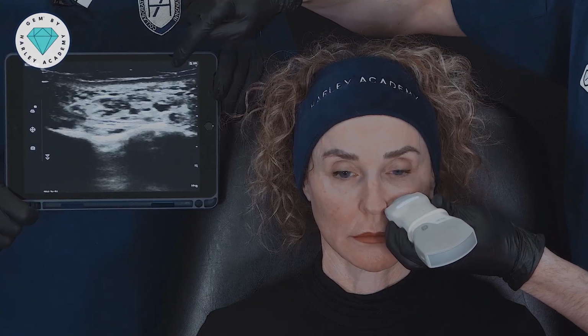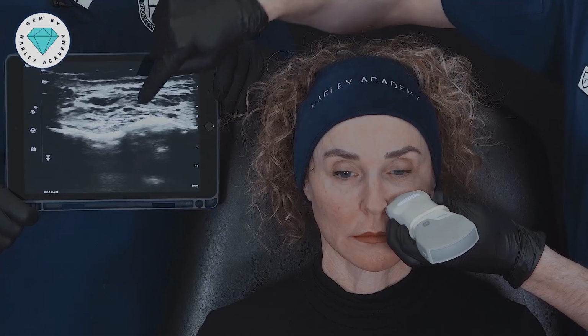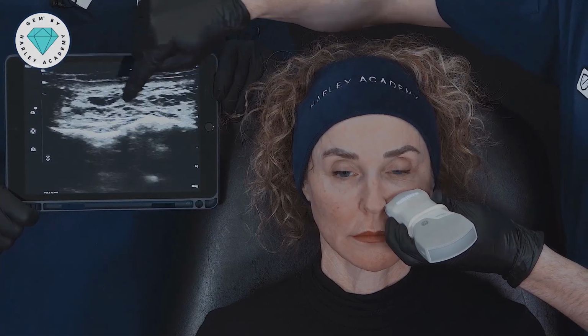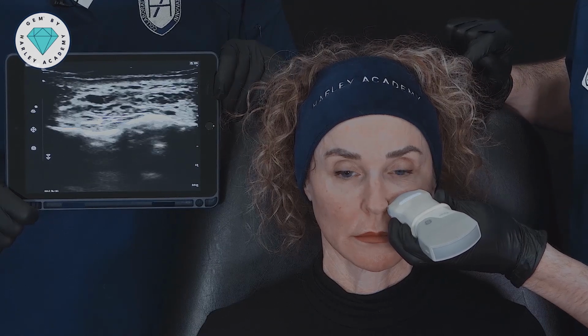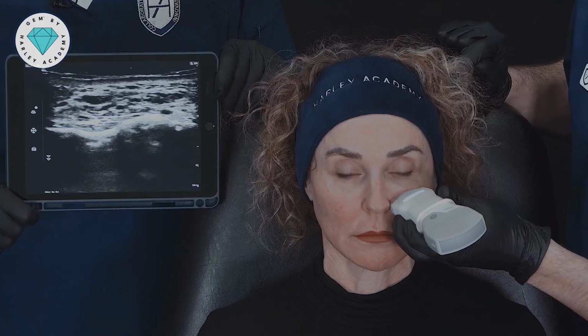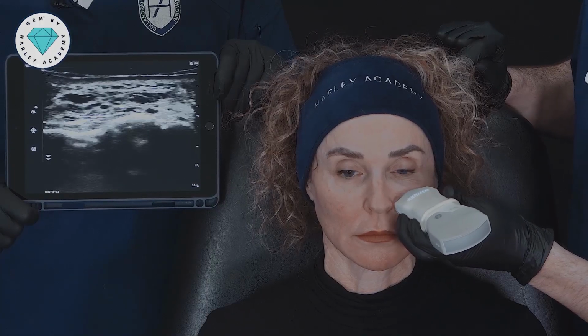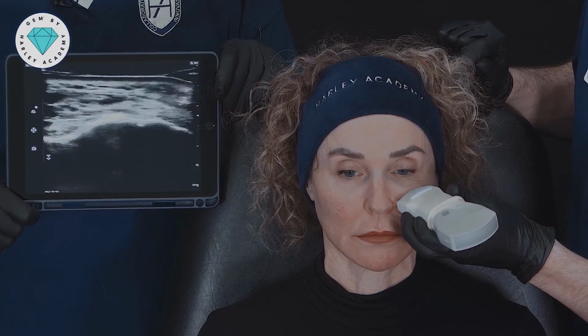Whether or not it shows up clearly on this camera, you can see these little black circles. That is filler that's sitting probably a little more superficially than we would like for deep fat compartment treatment.